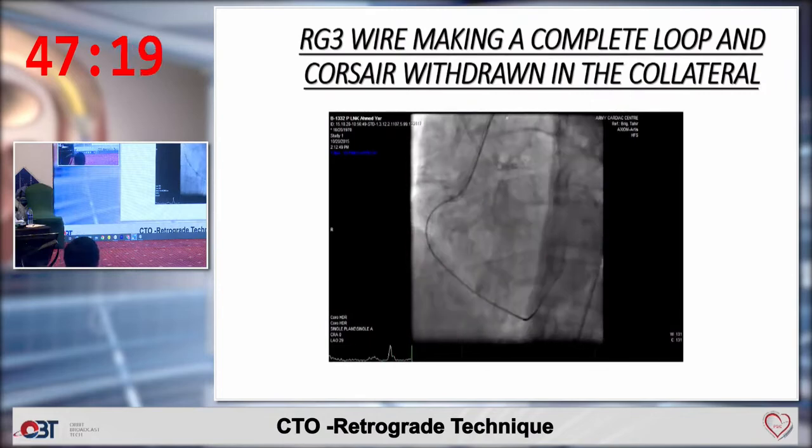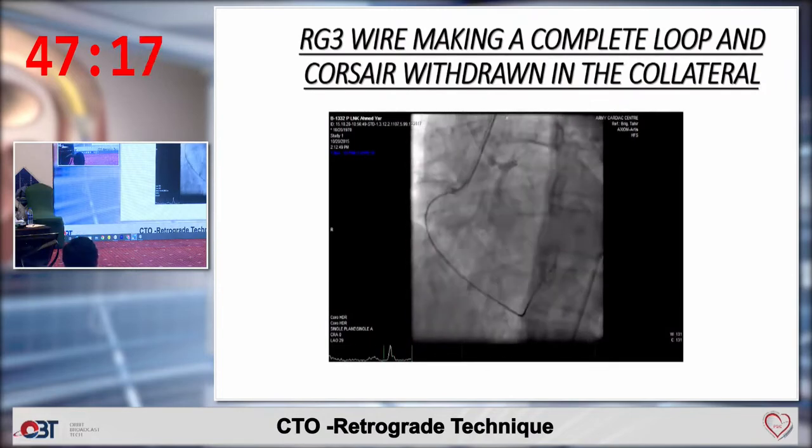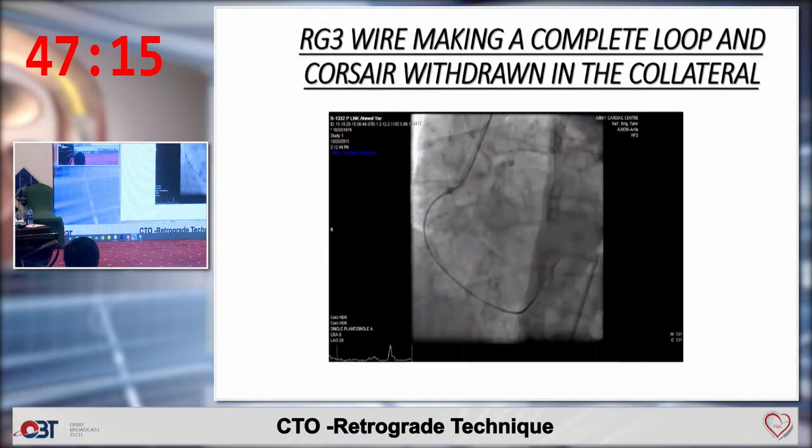So before externalization, is it worthwhile trying the reverse CART? Maybe the distal wire can act as a marker, then you can do it antegradely. Is that a possibility? Yes, that is a possibility.